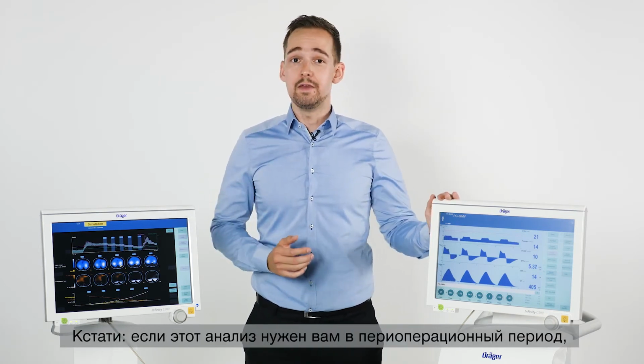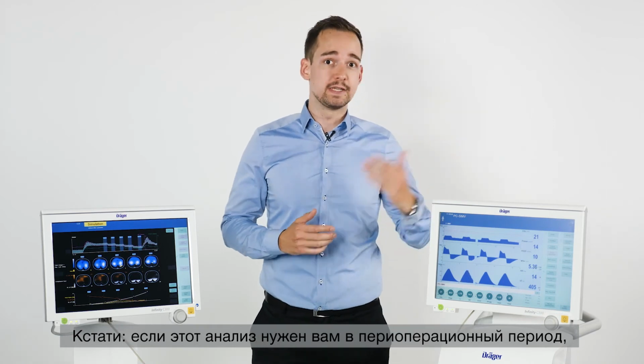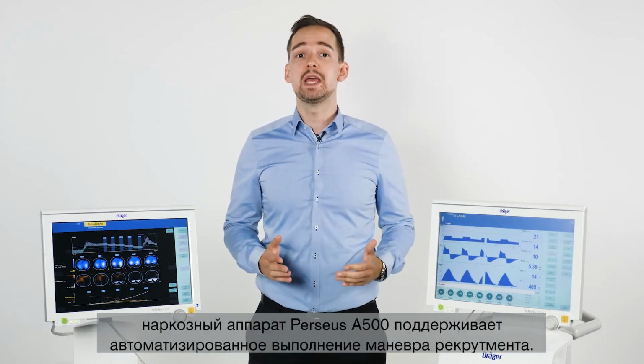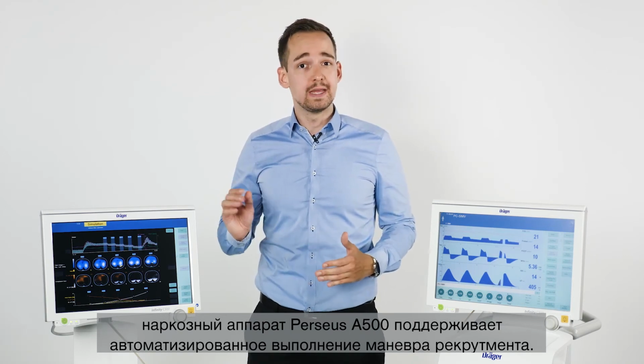By the way, if you are interested in this analysis in the perioperative setting, the Perseus A500 anesthesia device supports an automated PEEP trial.